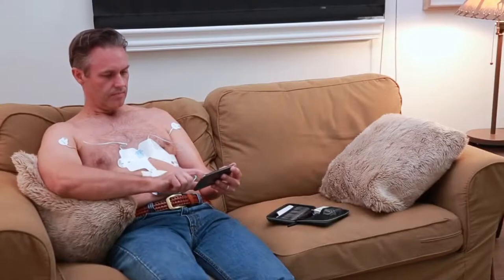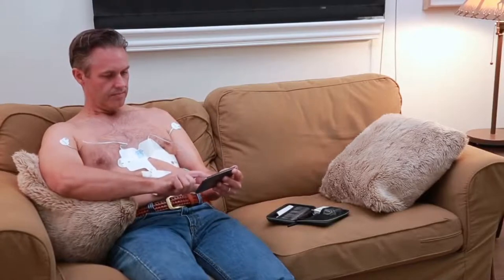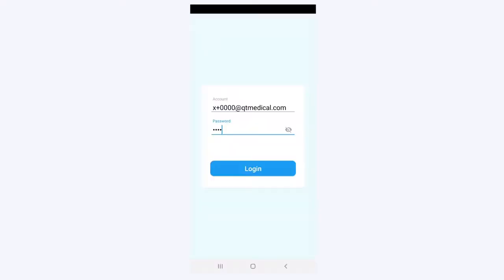Make sure your smartphone or tablet is connected to the internet and Bluetooth is enabled. Launch the app and type in the username and password shown on the cover page of your printed instructions.